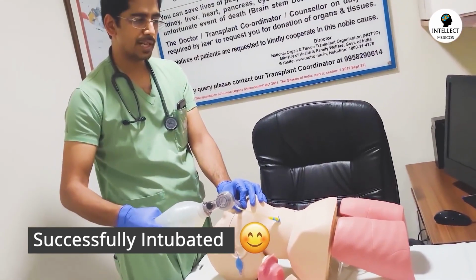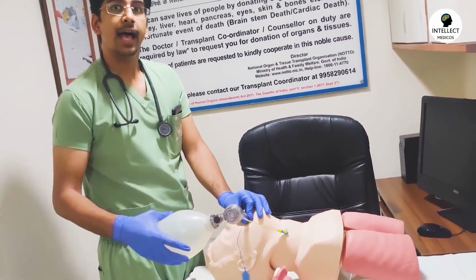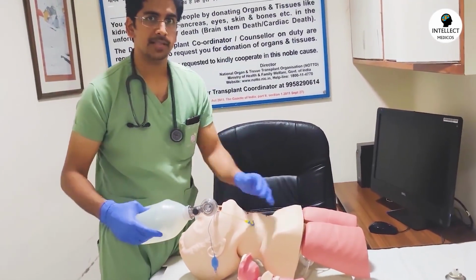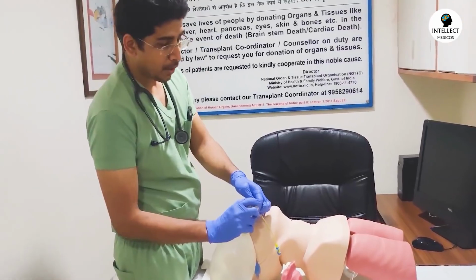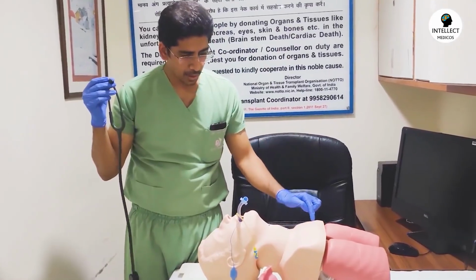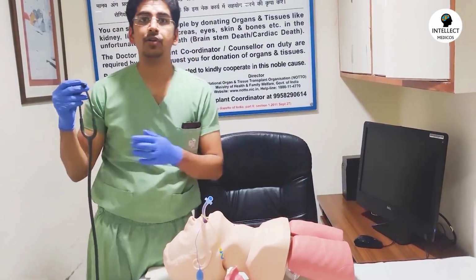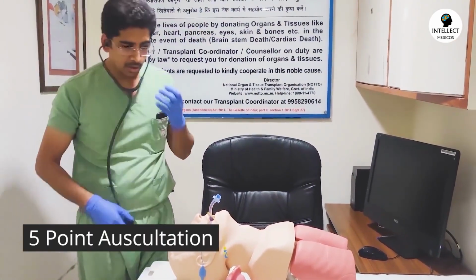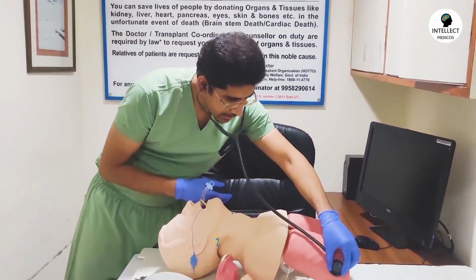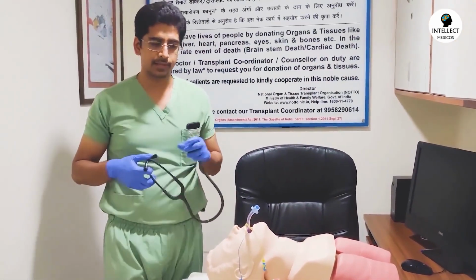You can see the inflation of the lung. That means this endotracheal tube is inside the trachea of the patient. Had it been in the esophagus, then you would not have got the appropriate chest rise. Now, after intubating, the important step is I will auscultate the two apices, two bases, and then the epigastrium. That is called 5-point auscultation. So, two over here, two at the bases, and one at the epigastrium. So this is called 5-point auscultation.